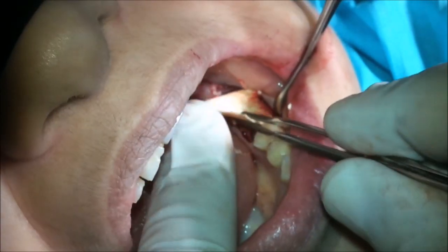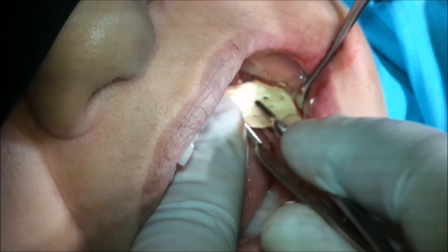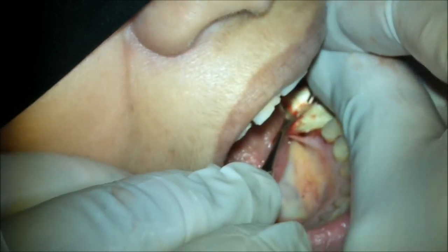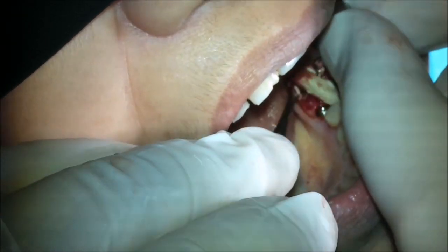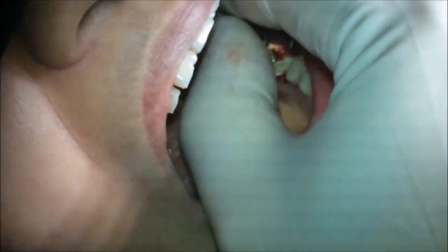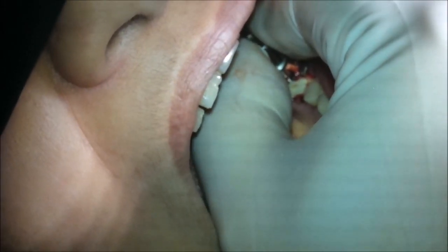Of course, we still can use the bone tack or the bone screws, but as we are going to use a collagen membrane, no need for re-entry to remove the membrane, and no need to use any material which needs a re-entry to remove. The disadvantage of this technique is that the cover screw area is a little bit loose because of the thickness of the membrane.